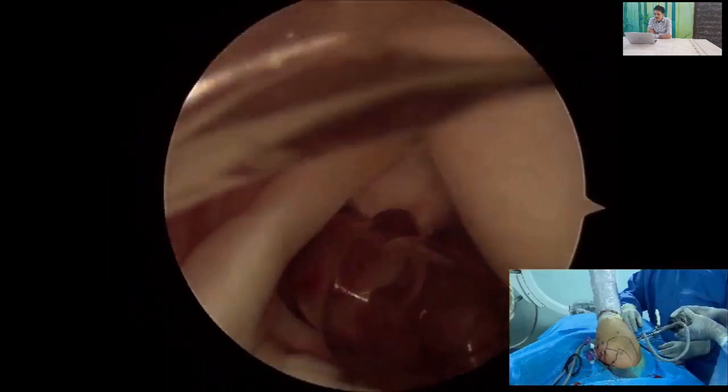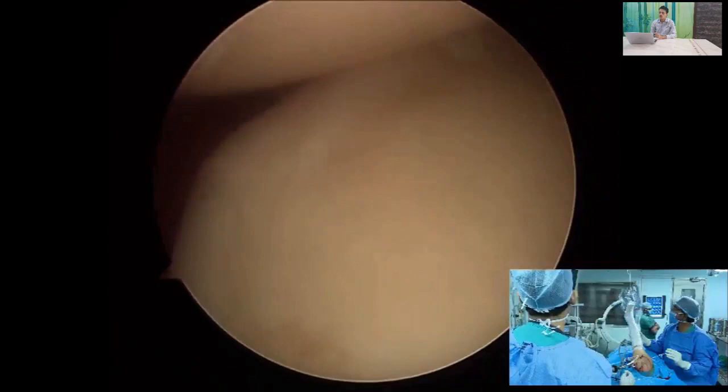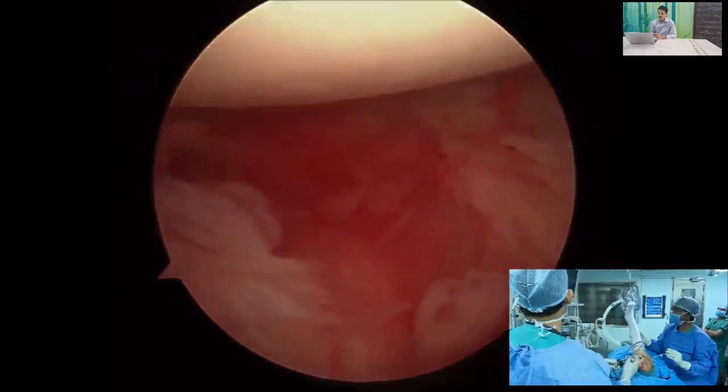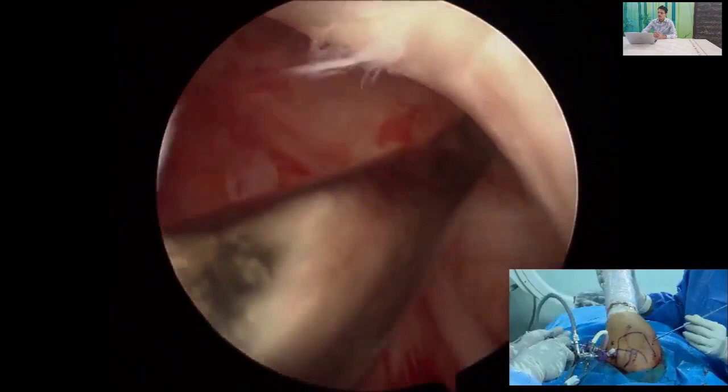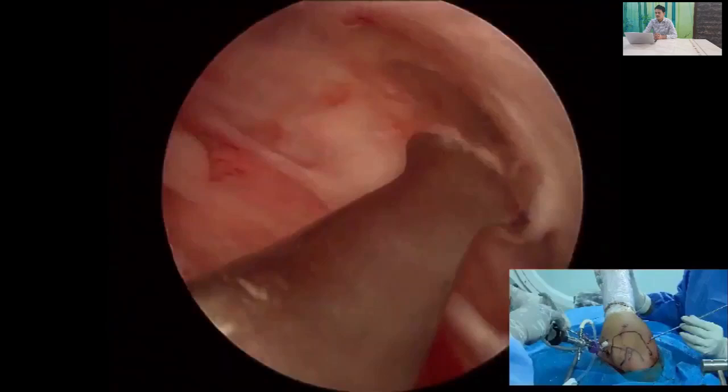We insert our scope in the anterior superior portal and can see that the whole humeral head is dislocated anteriorly. There is an ALPSA-type lesion. The most important step here is to release the ALPSA lesion down from the glenoid neck, alleviating it sequentially. You should go up to the subscapularis muscle belly.